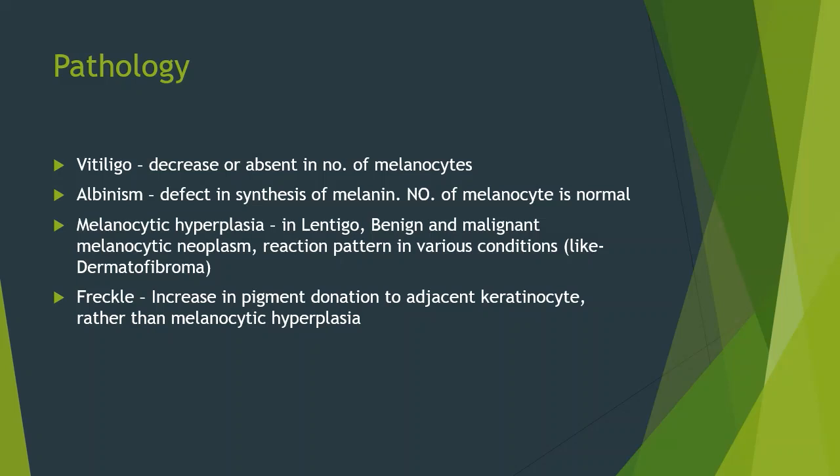Melanocytic hyperplasia is seen in lentigo, and in benign and malignant melanocytic neoplasms. Melanocytic hyperplasia can also be seen as a reactive condition with some other neoplastic disorder like dermatofibroma. In freckle, there is increased pigment donation to the adjacent keratinocytes by the melanocytes rather than melanocytic hyperplasia.